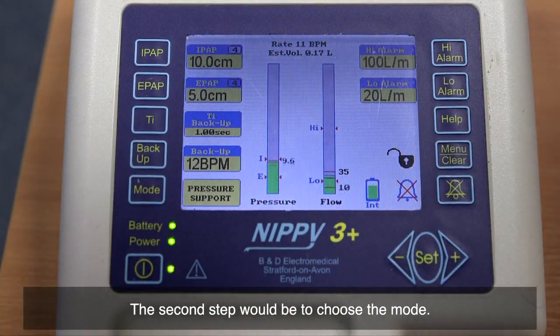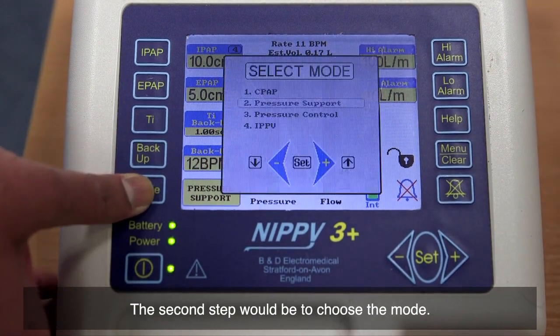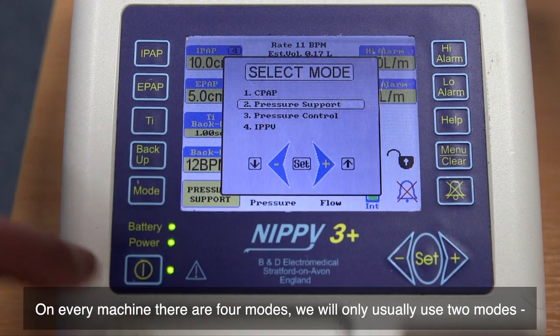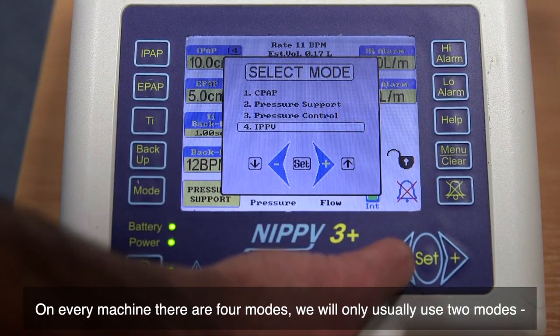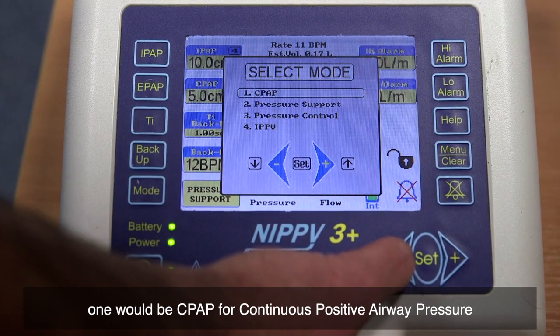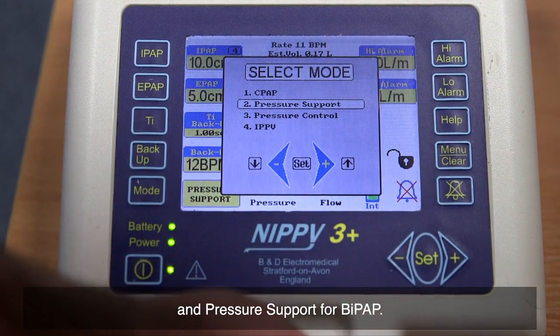The second step would be to choose the mode. On every machine, there are four modes. We will only usually use two modes: one would be CPAP for continuous positive airway pressure, and pressure support for BiPAP.